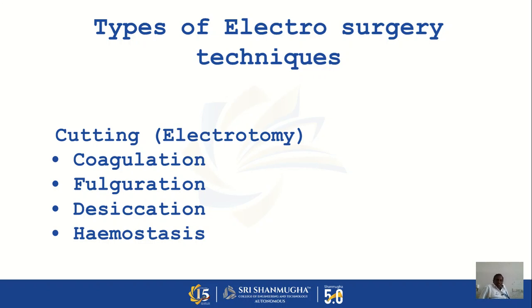what are the types of electrosurgery techniques in diathermy. Already I told you about diathermy. Dia means through, thermy means temperature. The temperature can be created by using electrical energy, chemical energy, mechanical energy, like that, any kind of energy. So that's why it is diathermy.